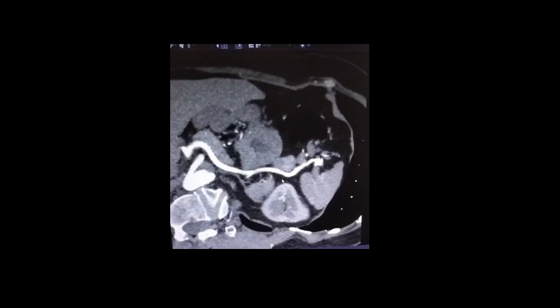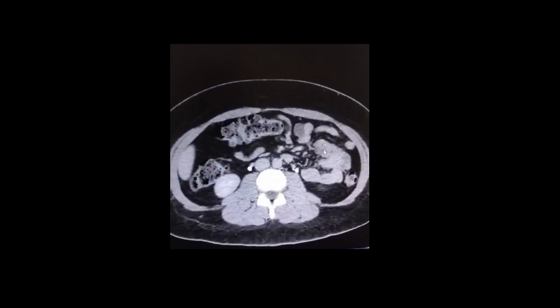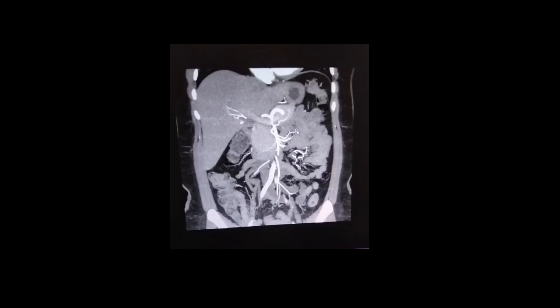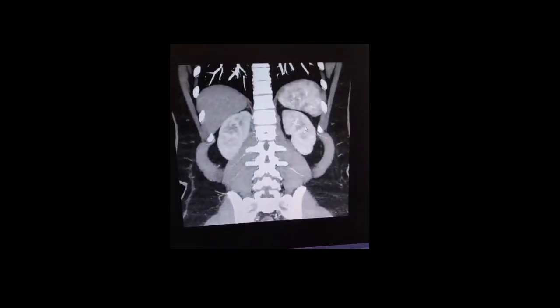3. Hepatic arterial phase, 17 to 25 seconds. Description: like early arterial but specifically focused on the liver. Image reference: liver images showing arterial phase enhancement, highlighting hypervascular liver lesions. Uses: detecting hypervascular tumors or metastases.